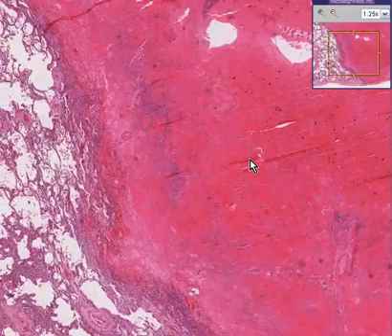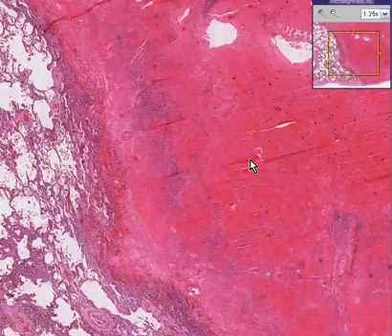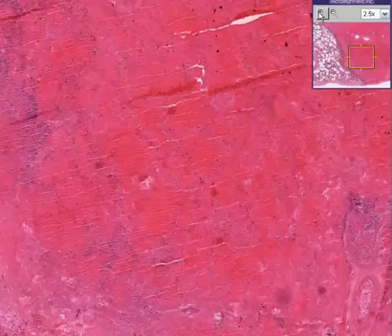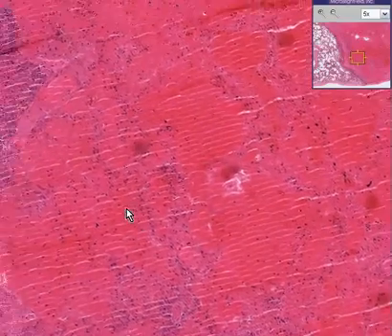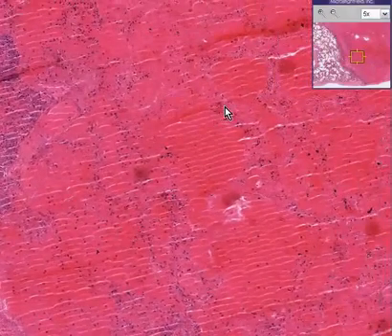I guess you could call this hemorrhagic necrosis rather than coagulative or liquefactive necrosis because most of it is blood. But like all other infarcts, you have a very, very hard time recognizing the actual detail of the lung because most of the cells are dead.